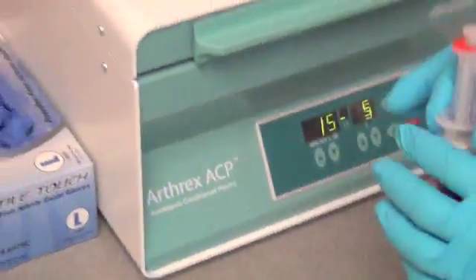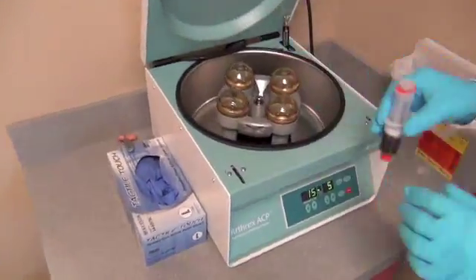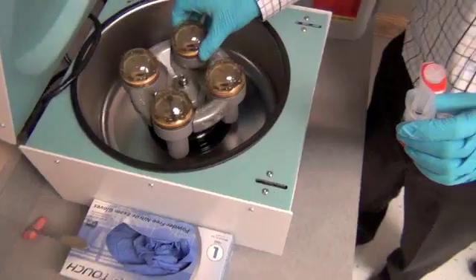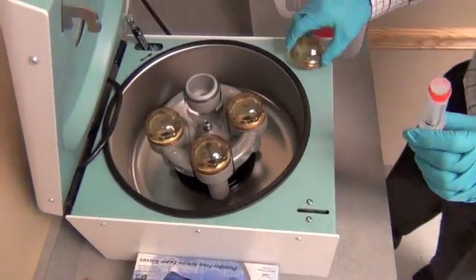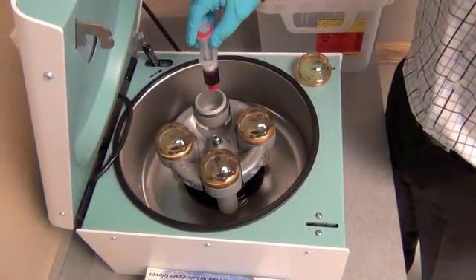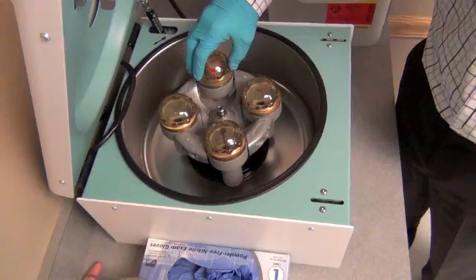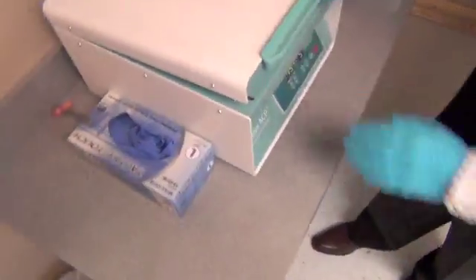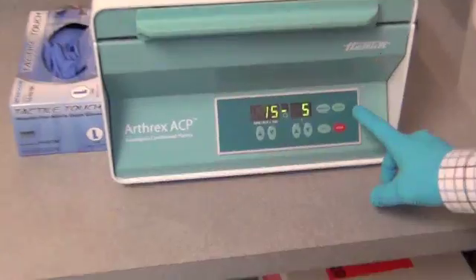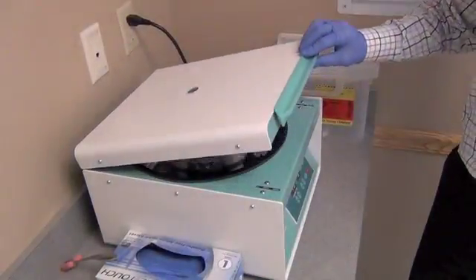We will then take that blood and place it into the centrifuge. One of the four cylinders has a counterbalance and we're going to place the blood in the cylinder opposite the counterbalance. If we wanted to, we could do two of these syringes at once. Now we'll close the lid of the centrifuge and get it started spinning for five minutes, which will layer out the plasma layer that has the platelets in it.